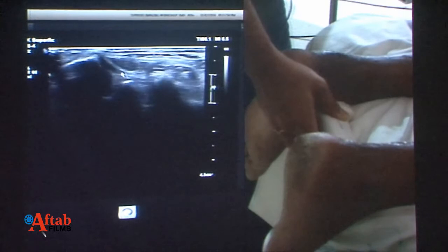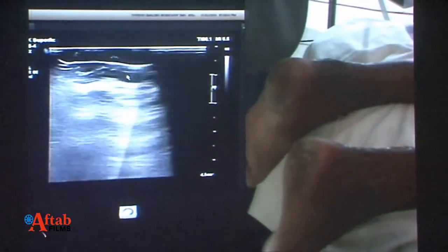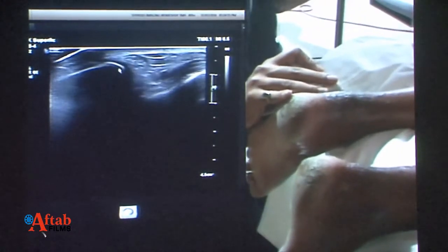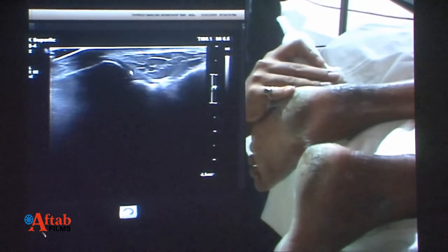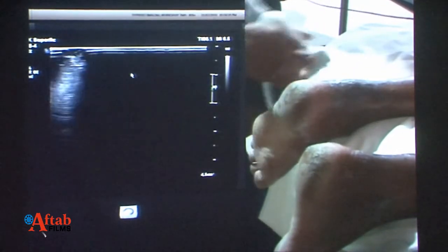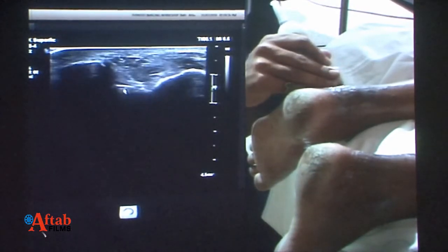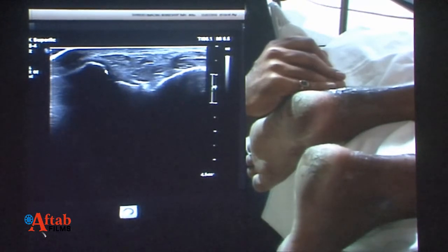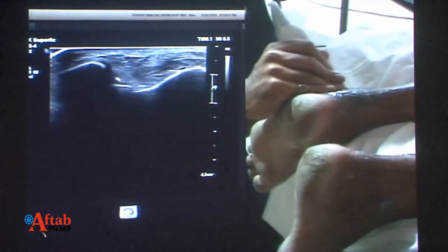For the calcaneofibular ligament, I identify the lower end of the fibula and part of the calcaneum on the lateral aspect, looking for any structure connecting them. The calcaneofibular ligament lies deep to the peroneal tendon, so a structure deep to the peroneal tendon is my area of interest. The calcaneofibular ligament can be somewhat difficult to demonstrate, but identifying it near the calcaneum and showing the thickened ligament if abnormal is the goal when performing ankle ultrasound.